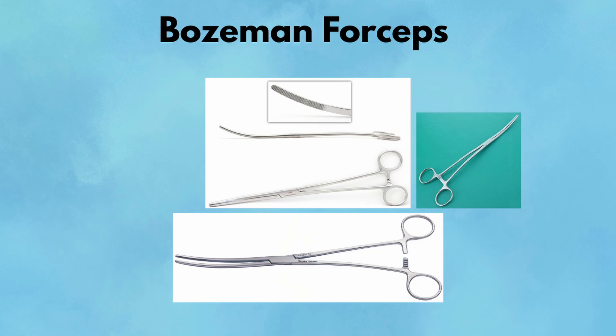Bozeman forceps. Originally a gynecologic tool, Bozeman forceps have earned their place in general surgery. Their long, curved profile makes them perfect for placing packing deep into the pelvis or posterior cavities, especially when fingers won't fit. You'll also find them useful for guiding surgical drains into position, grasping sponges, or maneuvering structures gently within deep spaces. Pearl: Great for maintaining sterility when you need to reach deep without contaminating the field. Pitfall: Don't rely on them to clamp tissue — they're designed for placement, not pressure.